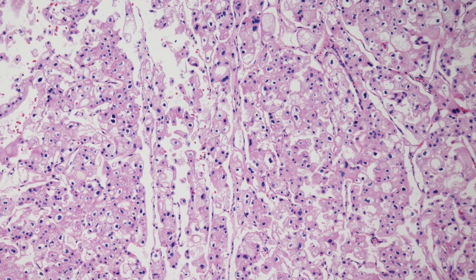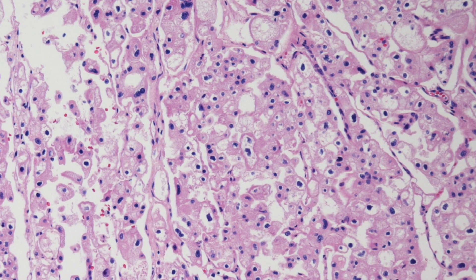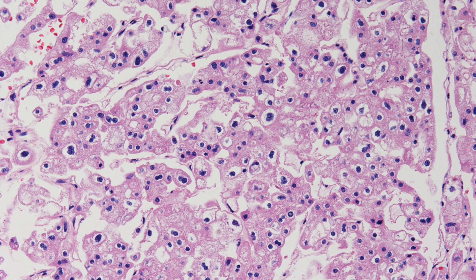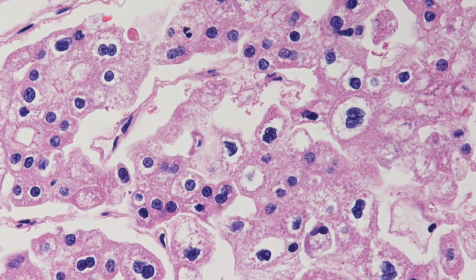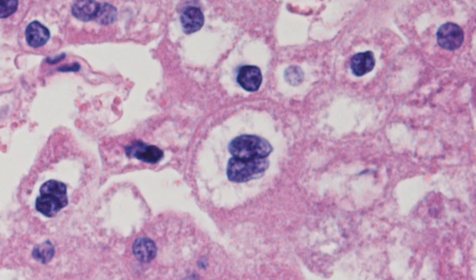In this example of chromophobe RCC, the cytoplasm is abundant pink staining. On higher power you can see the perinuclear halos very nicely, and also the plant-like appearance with the prominent cell outlines producing a cell wall-like appearance. At the highest power you can appreciate the rather irregular nuclear outline producing an appearance similar to that of a raisin.